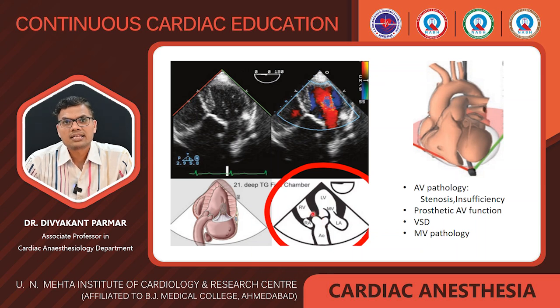We can also detect any VSD present or not, then mitral valve pathology, especially subvalvular apparatus or any systolic anterior motion of the anterior mitral valve leaflet present. We can also detect all these things in this view.